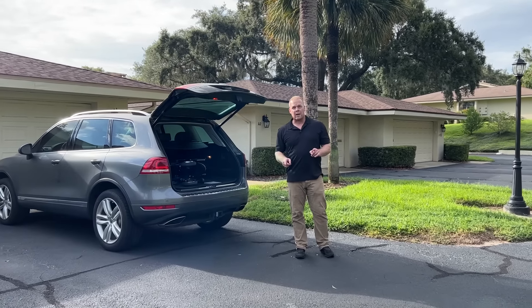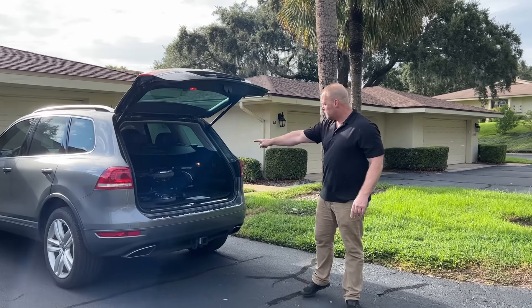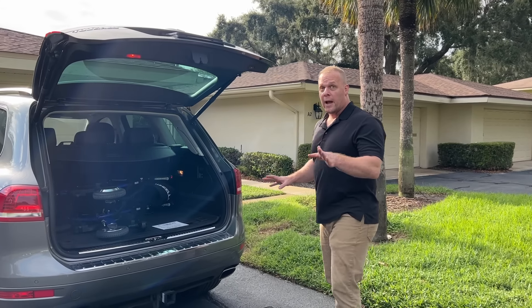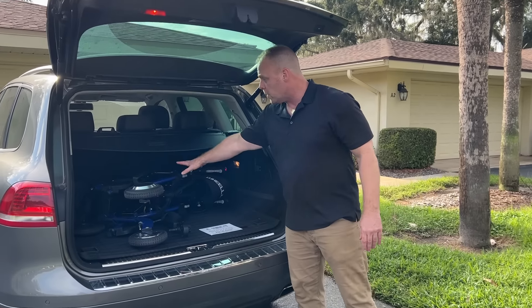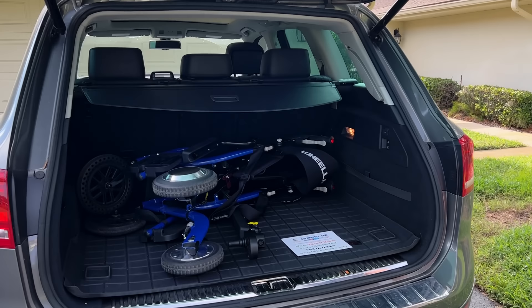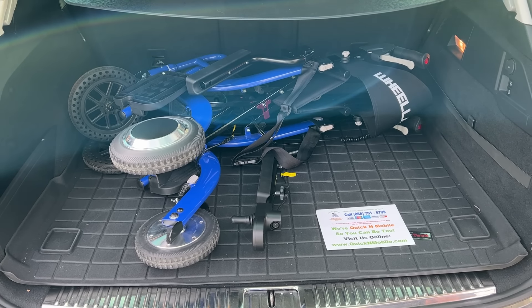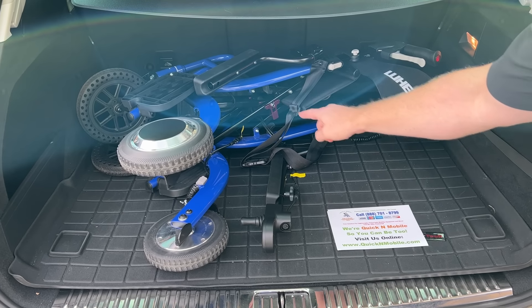Hello, this is Paul from QuickNMobile.com and we are here with probably the most exciting piece of walking equipment that I've ever had on this channel. So let's take a look at what we have in the trunk here. I just kind of folded it up and threw it in the trunk, but you can actually stand it up as well in the trunk. This is the Wheelator.